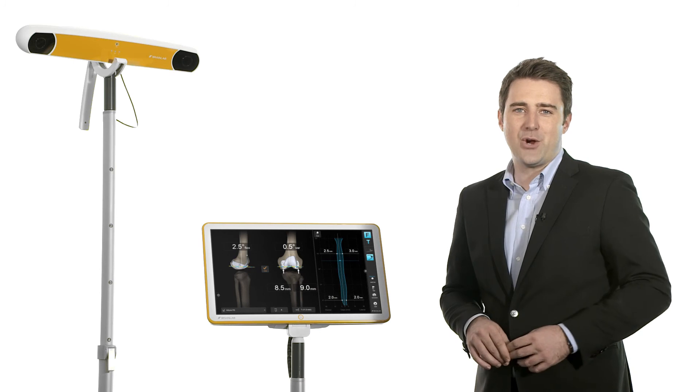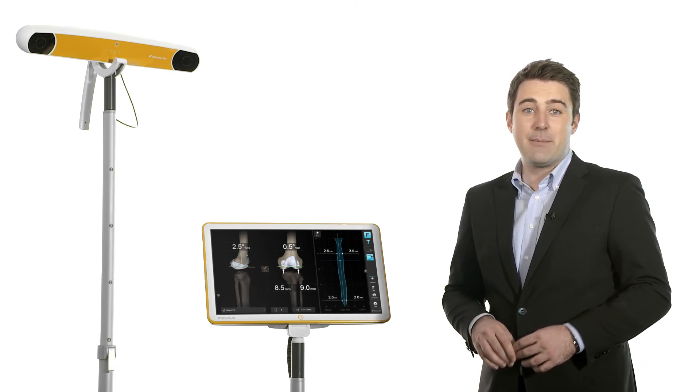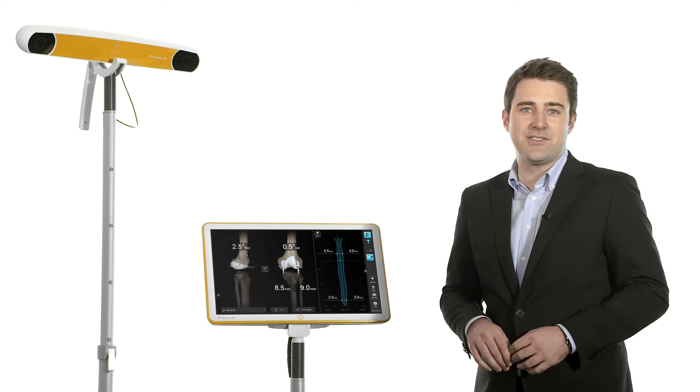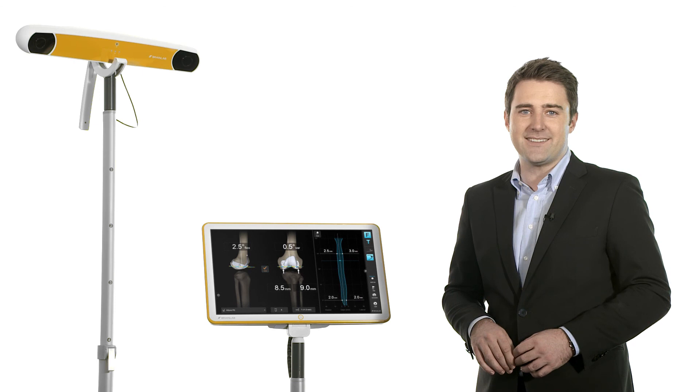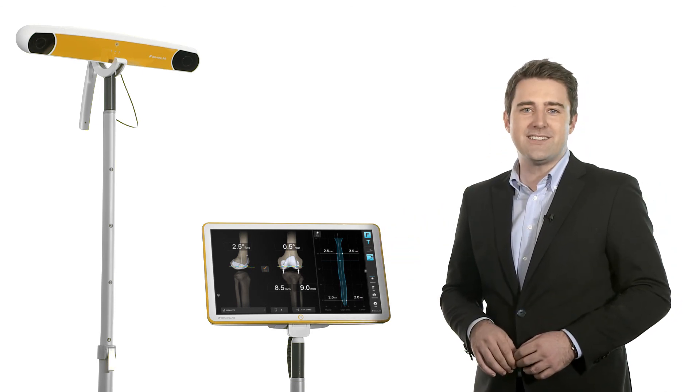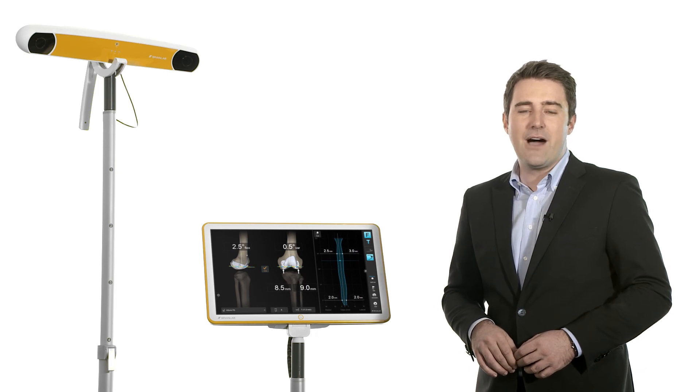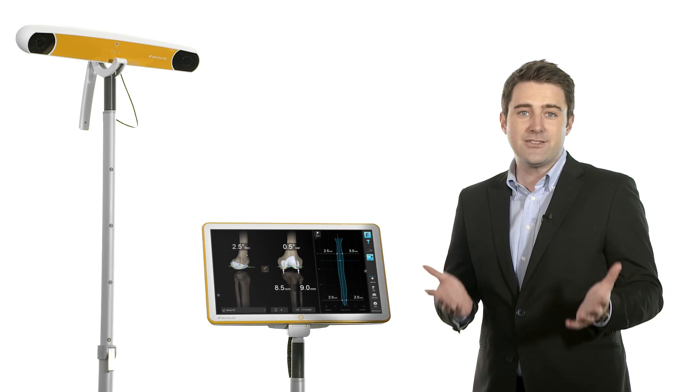The intuitive software approach allows surgeons to adjust to the surgical environment, thereby potentially decreasing surgical time and providing the flexibility to manage unforeseen circumstances on the fly. Knee3 marks a new generation of software-guided knee surgery, which places the power and control of orthopedic navigation in the hands of the surgeon.